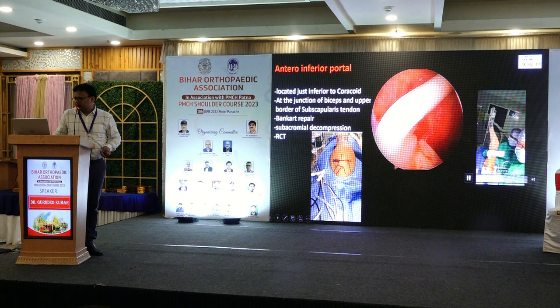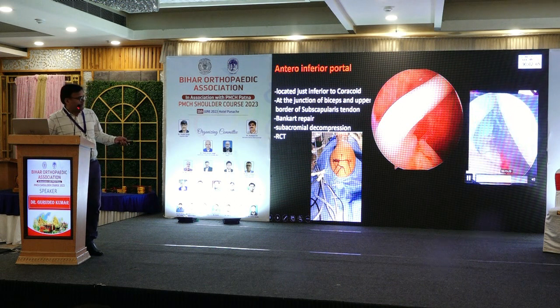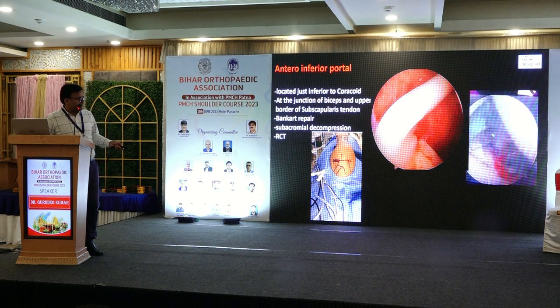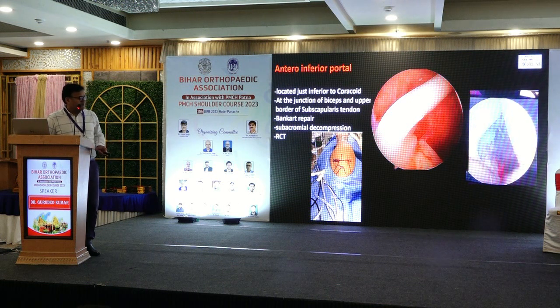And these are the two portals, anterosuperior and anteroinferior. Keep 1 centimeter of gap between these portals, otherwise there is overcrowding of the cannula. This is a very important working portal for addressing instability cases.